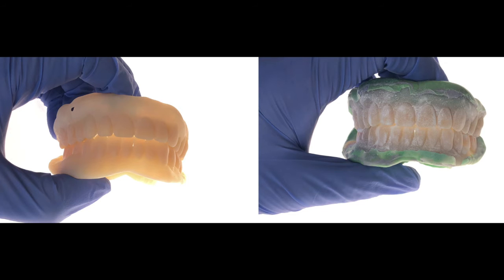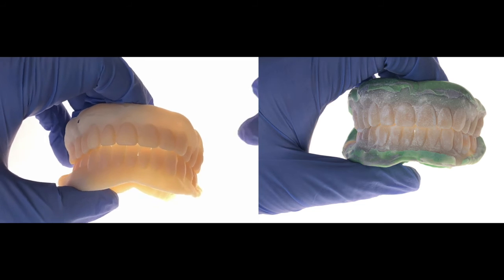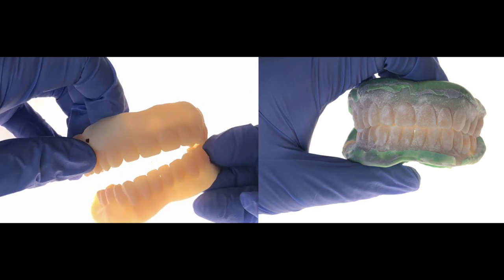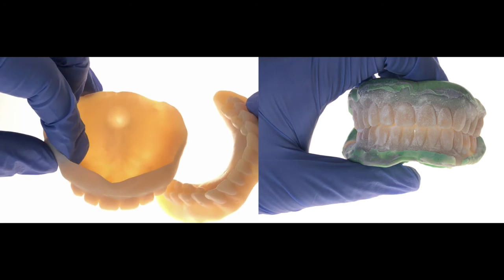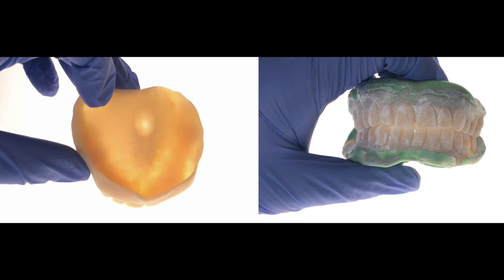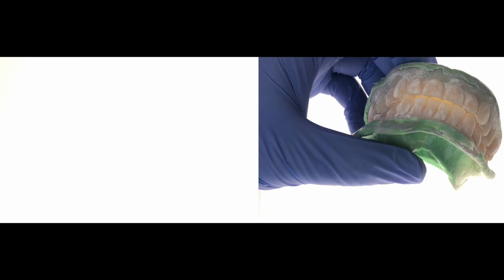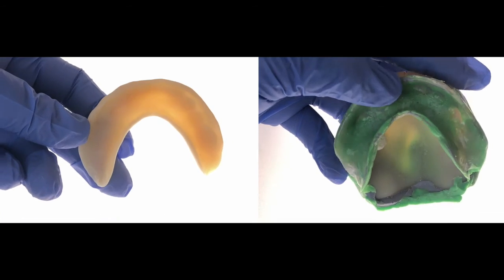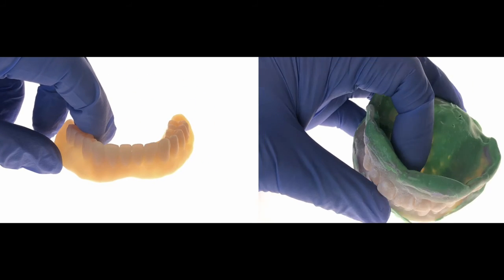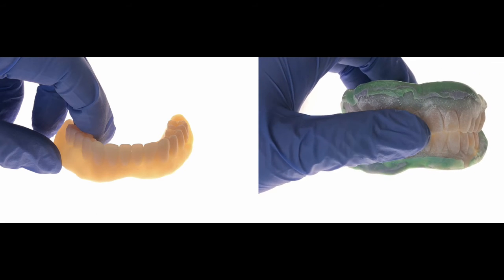So this is the try-in, and the right side is after we get the wash impression with the border molding. And we scan this one, and we're going to use this new healed surface when we fabricate the final denture.